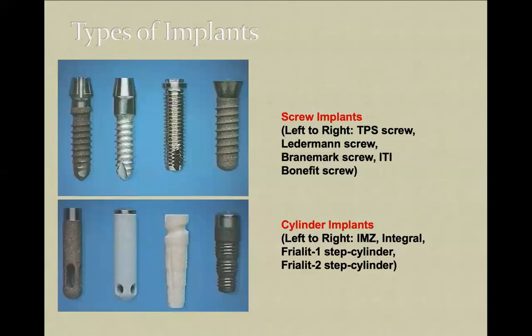It's a really long implant, because it should be placed here in the zygomatic bone. And the maximum length for the All-on-4 concept, I think, is 24 millimeters, because it should be placed like this, oblique, not perpendicular. But usually, minimum is 6, maximum is 16.